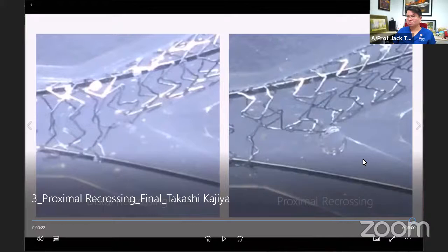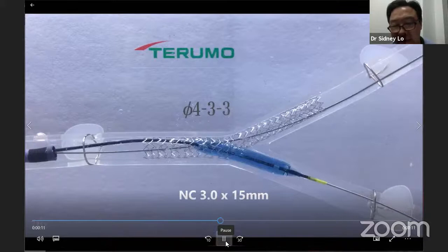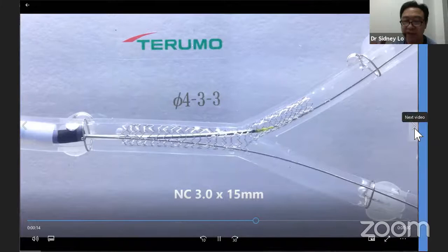So I think it's hard to know, because I don't think we systematically know where you've recrossed. We don't systematically do stent boost or clear stent to see the stent distortion. And you've seen on the bench, it looks much better if you distal rewire, because there's much better distribution and coverage of the ostium of the side branch, even if you do provisional. So I think it's not necessarily correlated with clinical outcome, and we don't know. But I think that generally it does probably increase MACE events in the side branch because of the change in the flow dynamics and shear.